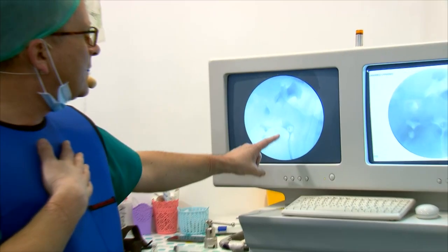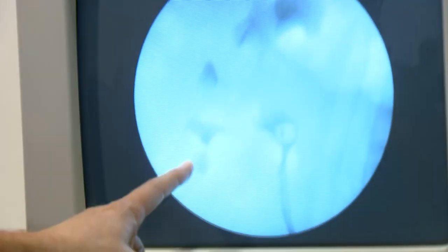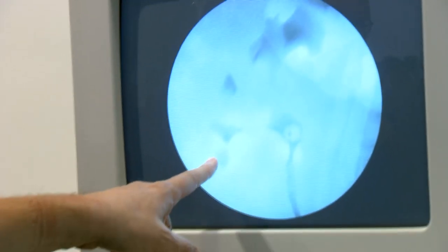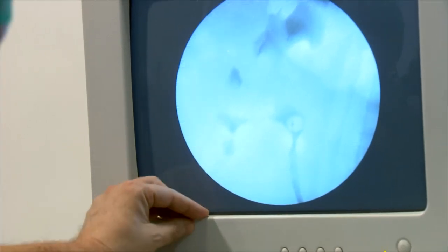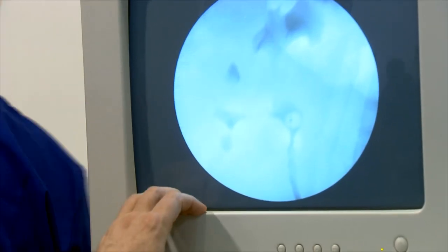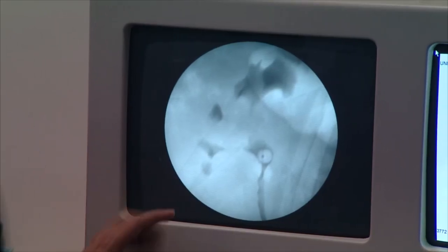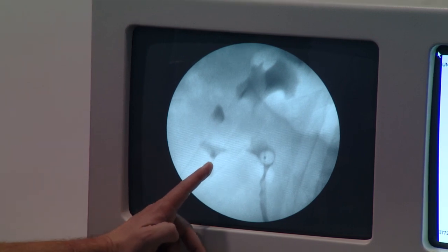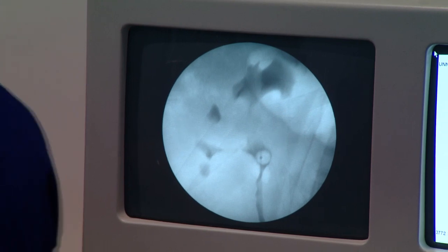Okay. This is the balloon catheter in the renal pelvis. This is the lower calyx, and the lower calyx has two branches. This is the lower branch, and the upper branch. The question was whether we should do a multi-track puncture or not. My suggestion is that we puncture the lower calyx, and then we can approach the other calyx like this. What is your opinion?